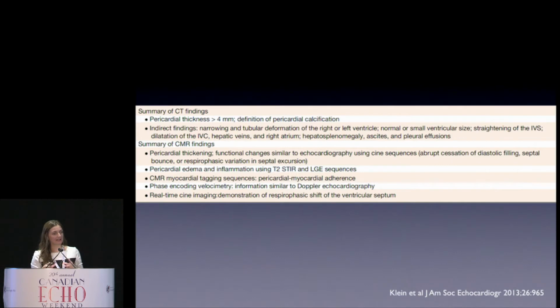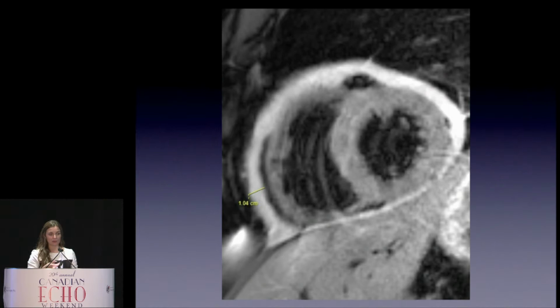And we often use the incremental data from CT and cardiac MRI to look at anatomy, as well as other physiologic factors on the cardiac MRI cine imaging. And this patient went on to have that, and we can see on these two T2 weighted SPAIR images a thickened pericardium measured 10 millimeters, normal is 2, and we can see how bright it is, which is consistent with edema.